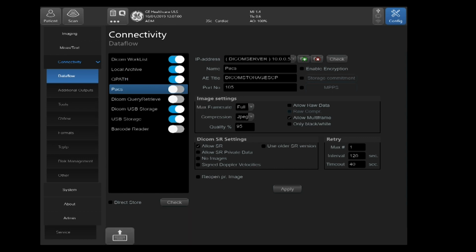Please note when selecting direct store that as soon as you press the button to save the images to the ultrasound machine, it will store directly to your archive on your device and send to the PACS at the same time. It will not do it at the end of the exam as you typically would expect.